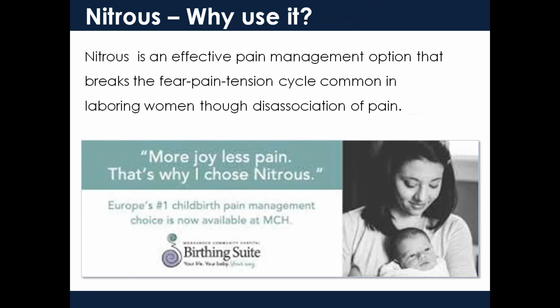We've had people, and there's a YouTube, Lisa might be able to share with this group if you're interested, but we had a patient do a YouTube interview for us, and she talks about just using it. Her intention was to have an unmedicated delivery, and she, I think, feels like she somewhat achieved that. She talks about using nitrous to just sort of reset her. So when she was feeling like she was getting out of control, she would use nitrous for a few contractions, and then once she was feeling a little bit more calmed down, she would stop using it. Because it's patient controlled, that's a clear benefit for the women who really want to be able to sort of titrate their intervention, if you will.